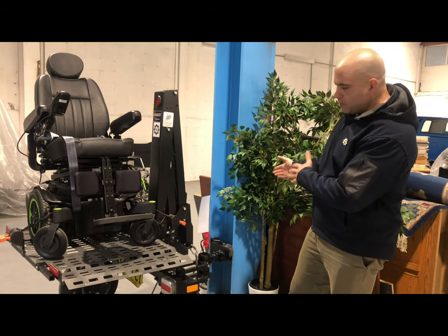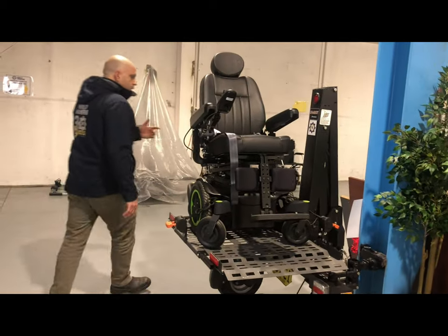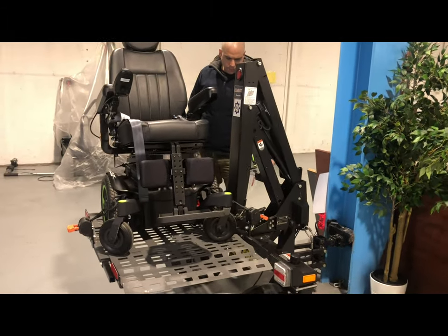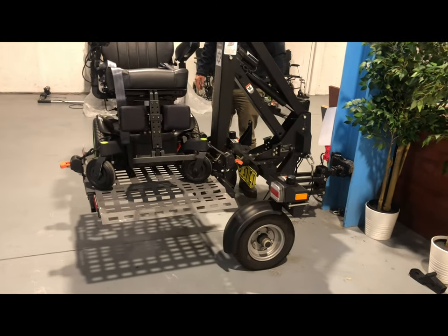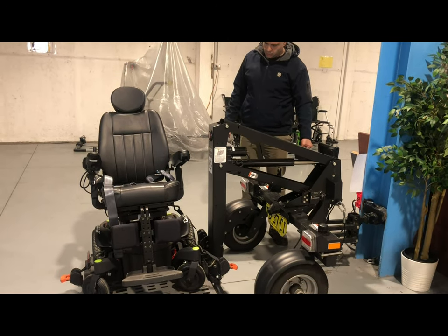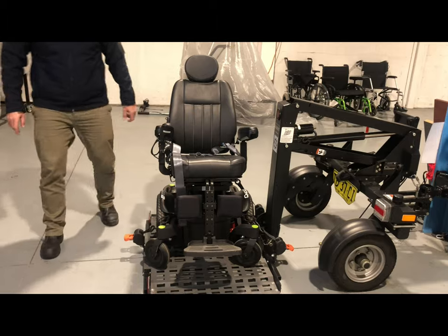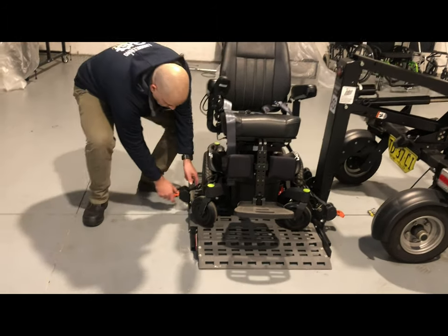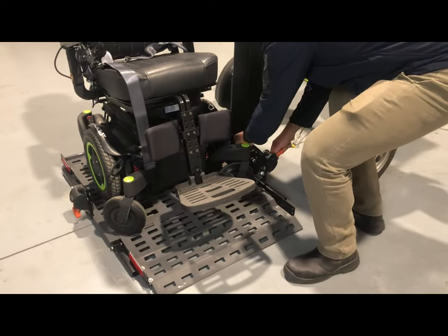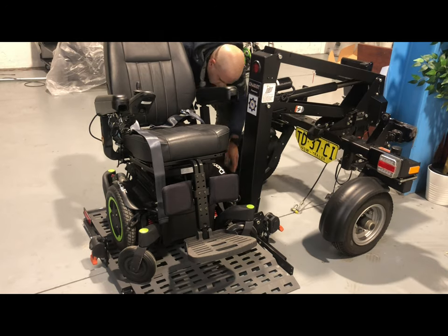When I want to unload it, I drop the platform via an electronic mechanism — it's connected to your vehicle's power supply. The wheelchair or scooter is secured down by security straps that are fully rated, self-tensioning ratchet straps. You undo your straps — you can even undo them while it's elevated, depending on your abilities and what you're comfortable with.